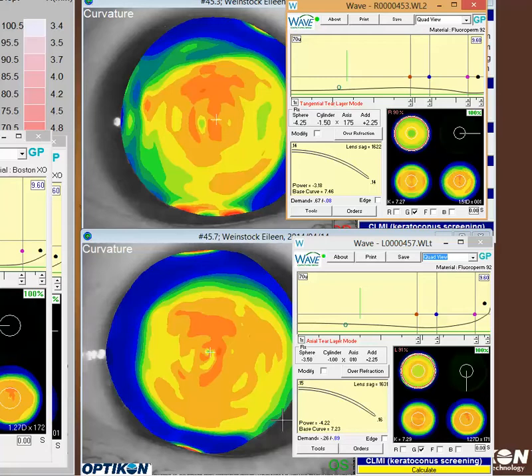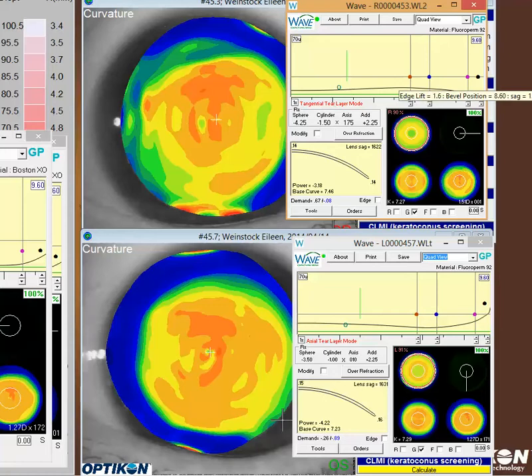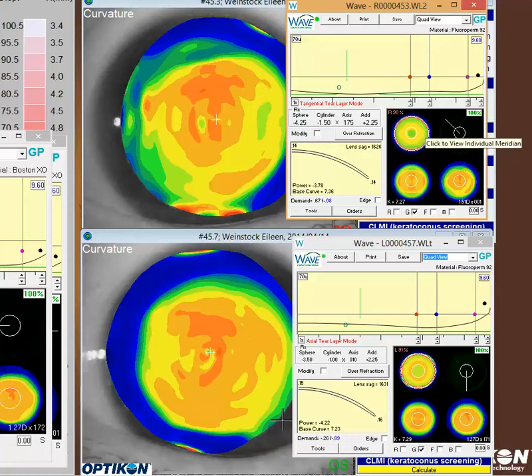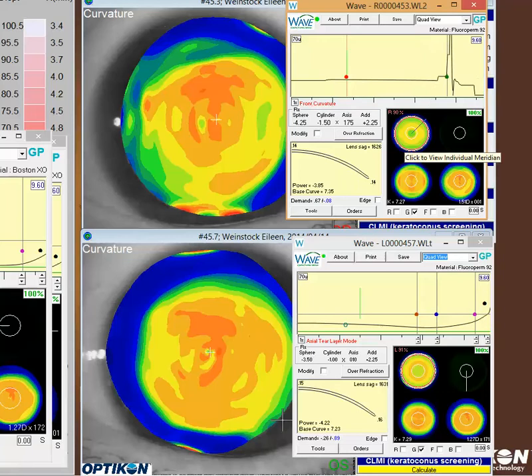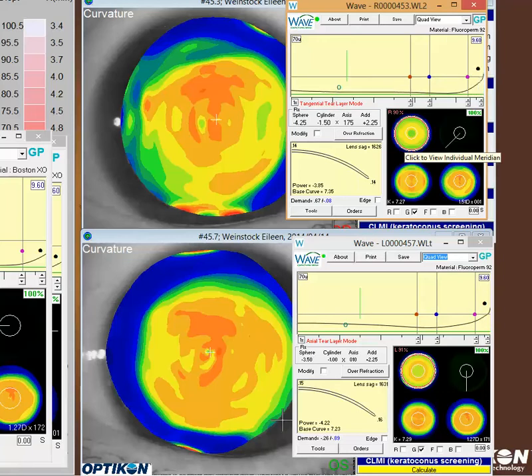Now let's talk about the fit itself. This right lens tends to be moving up and down. What you really want to do is maximize the landing zone — that's the area between the blue and the pink, the main landing zone of this lens. Looking at your lens, you have a little bit of alignment in this meridian, but as you go around you can have a lot of fluctuating up and down, which will tend to cause unpredictability with the fit.